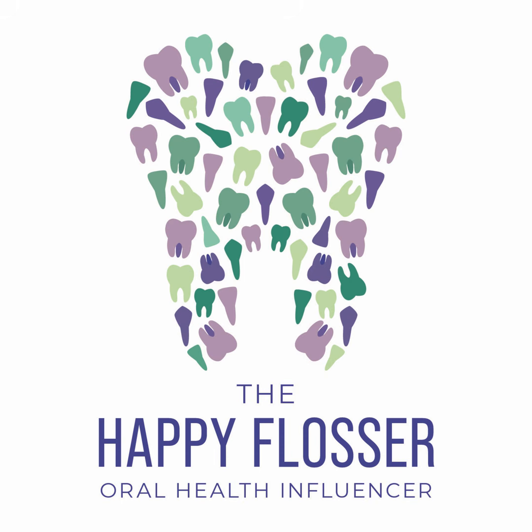Maybe they've showed up at the office because they have an emergency visit. They've had some kind of trauma. Or perhaps they've just undergone endo treatment, a root canal. Maybe we're monitoring an implant the patient has had placed that they're having trouble with. What is their family history? These are some of the questions that you want to be asking your patient or discovering through that assessment phase.